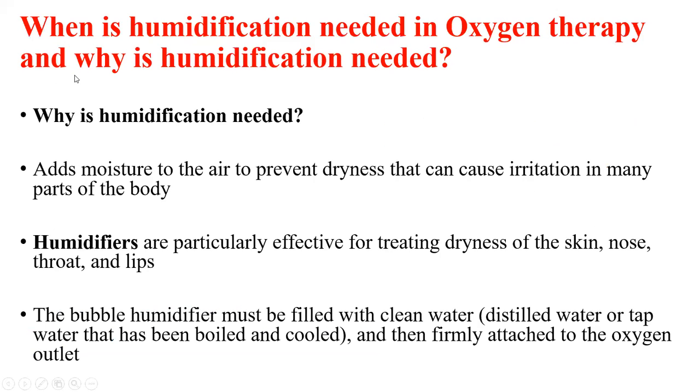The next slide looks at when humidification is needed in oxygen therapy and why. Humidification is needed because we want to prevent dryness of the airway. If the airways are dry, they cause irritation.